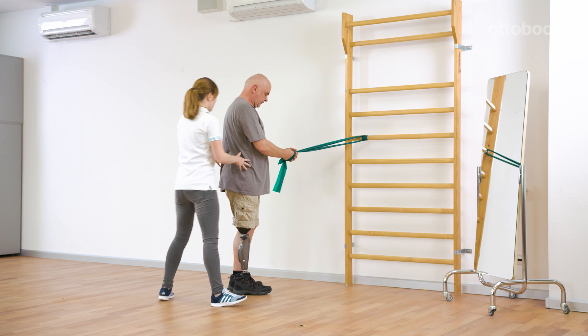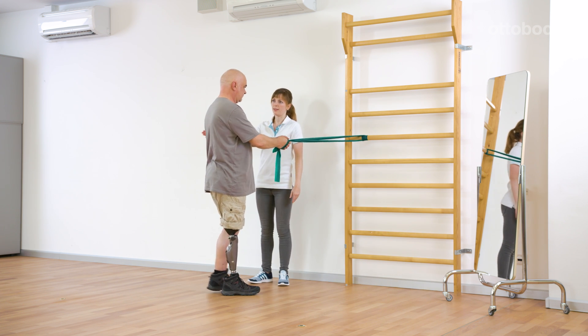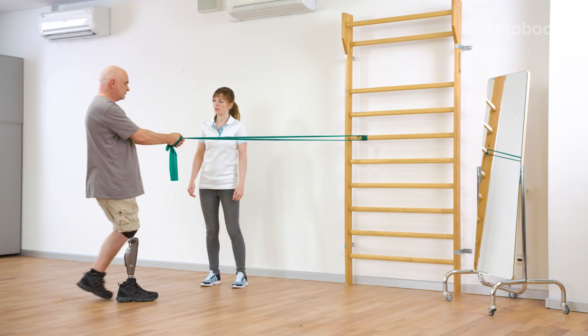It is also possible to move forward and backward against the tension of the strap. This exercise additionally trains slight yielding steps using the stance flexion resistance.